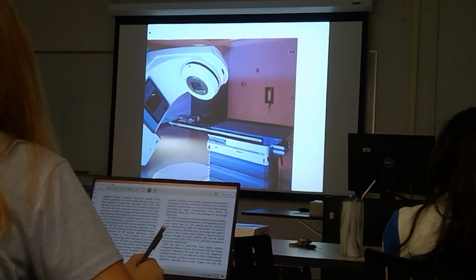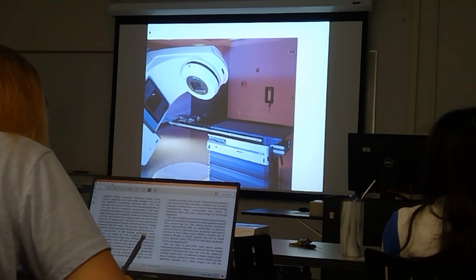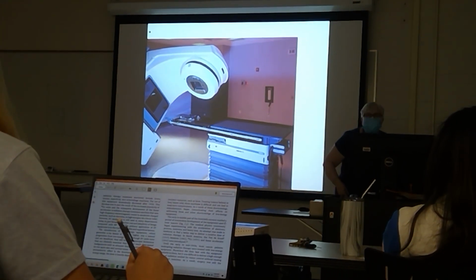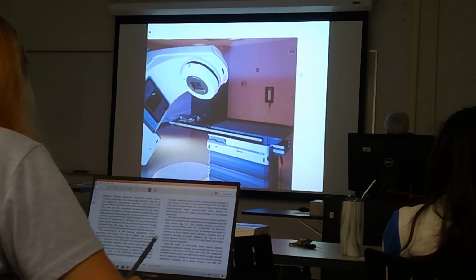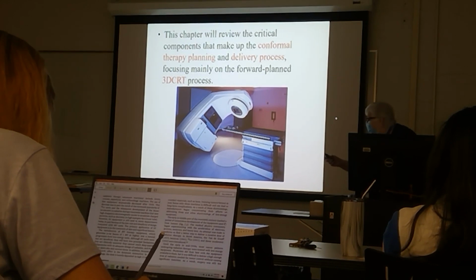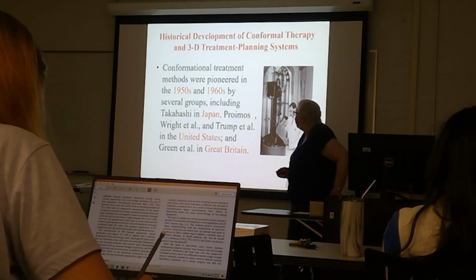So you had to move them, or you had to move the bed to match what type of field you had. Nowadays, with the carbon fiber, you don't have to care, or you do, but you don't have the same thought. Oh, okay. Does that make sense to anybody? Yes, no, maybe, don't care? Yeah, okay.